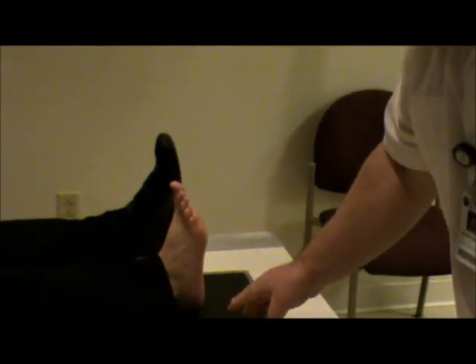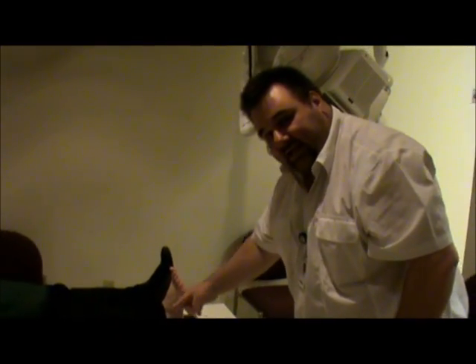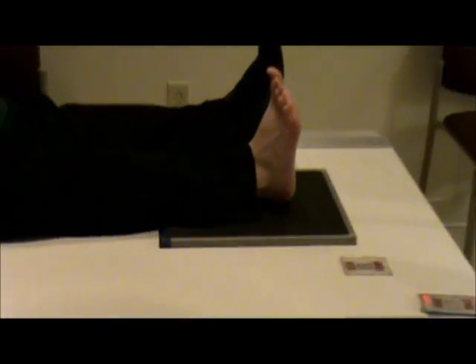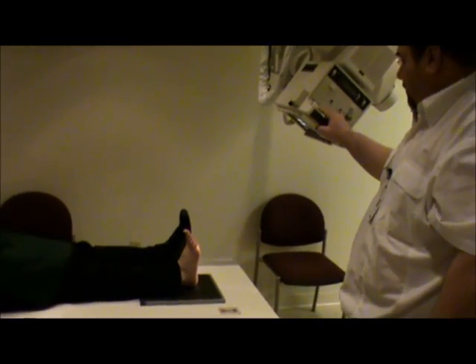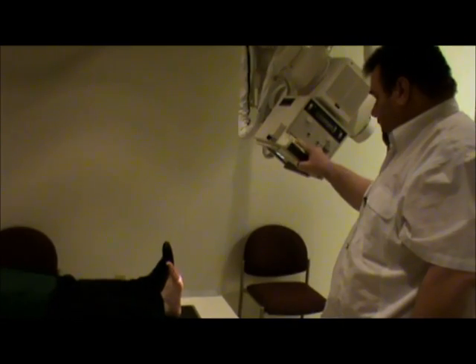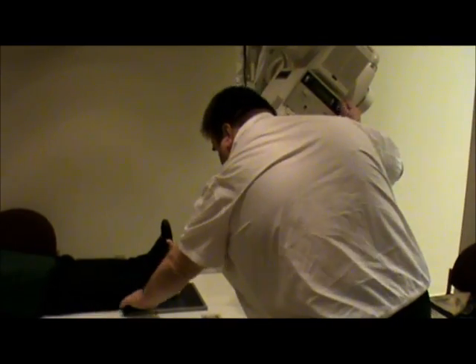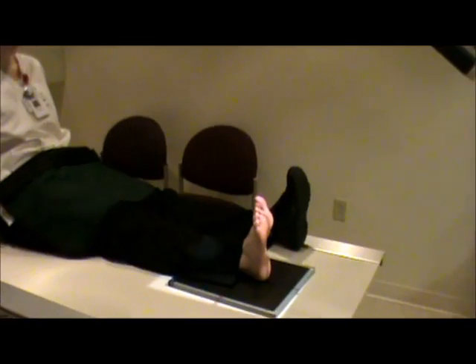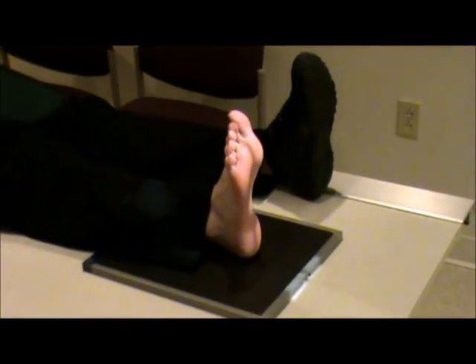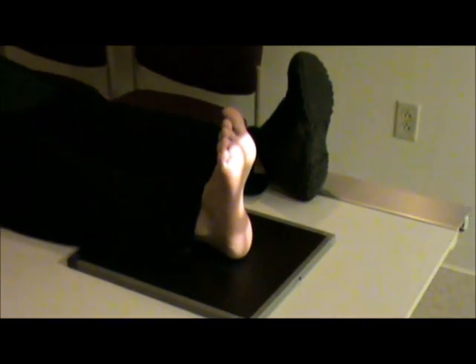As I'm centering, I'm also positioning because I am going to be angling, so I know the film is going to be a little bit higher because I'm throwing the calcaneus up on the film. We're going to have the patient dorsiflex the foot, and our centering is going to be to the third metatarsal and to the center of the bottom of the foot. I'll open up my collimation to confirm I'm at the center of the foot and the center of the film. Then our collimation comes back in to the skin margin side to side to get all the calcaneus on there.